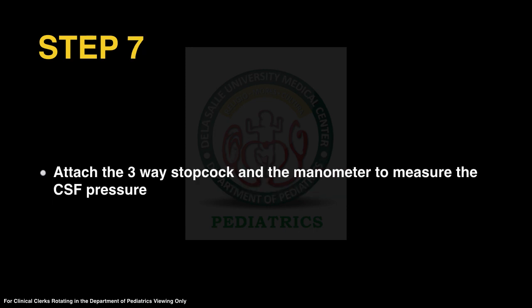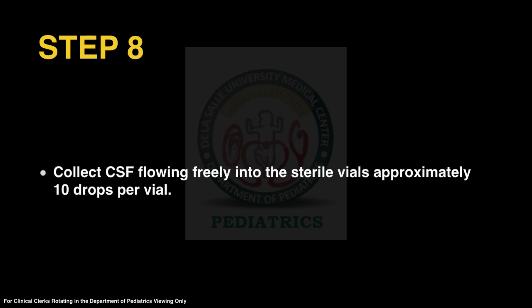Also, we need to attach a 3-way stopcock and a manometer to measure the CSF pressure, followed by carefully collecting the CSF, which is freely flowing, into the sterile vials, approximately 10 drops per vial.